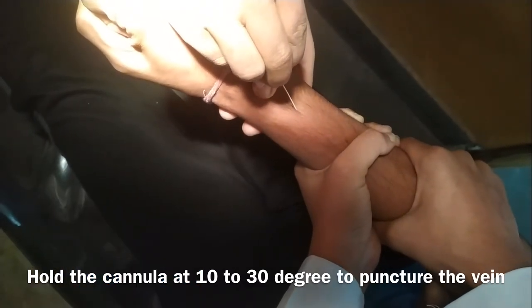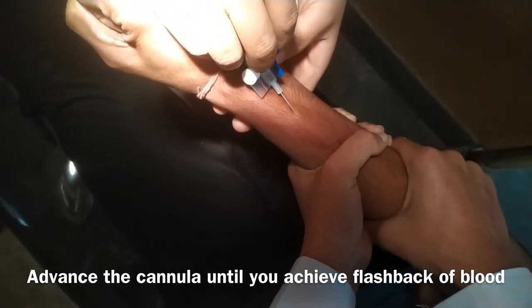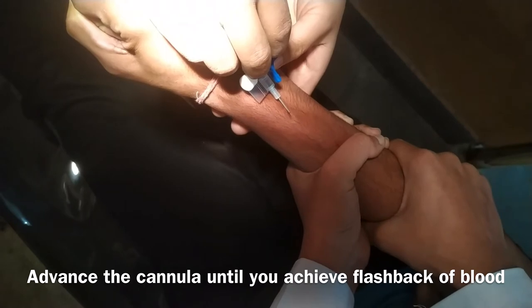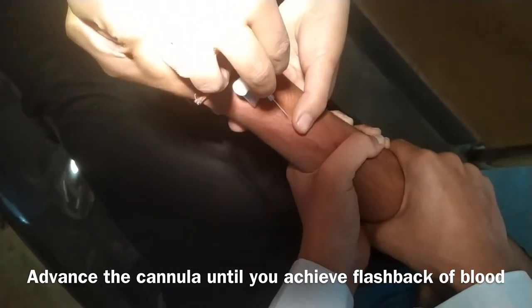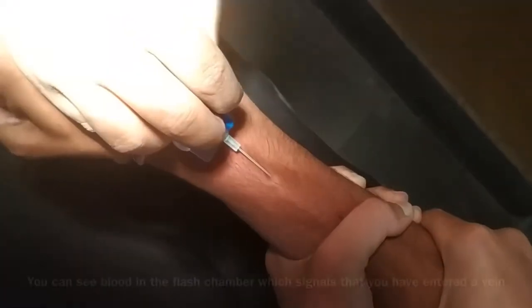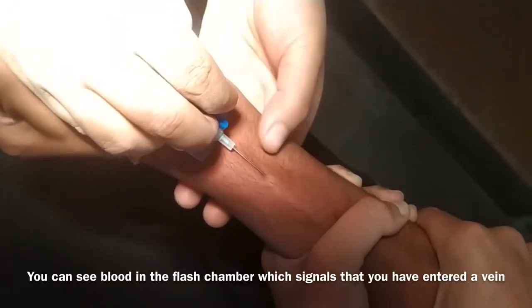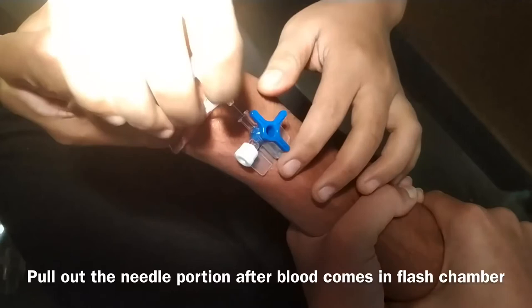Hold the cannula at 10 to 30 degrees to puncture the vein and advance the cannula until you achieve flashback of blood in the flashback chamber. I'm inserting it — I'm advancing the needle. Keep inserting until you see flashback of blood. Now you can see there is flashback of blood, which means you have entered the vein.